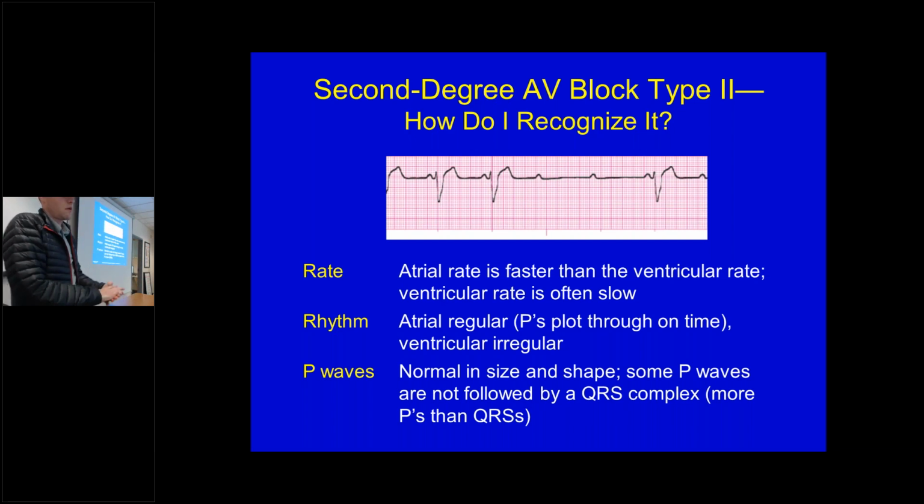So why would, in that big space of missed beats, why don't we see the Purkinje fibers pick up and pace like that? It might not be long enough, or the SA node is still firing, and it is incomplete, so you're not getting those escape beats, right? You don't always have escape beats. Sometimes you'll have arrest for 5 seconds, and there'll never be an escape beat. So that's not automatic. If there's a period of arrest, you're going to get an escape beat, that's not automatic. It's just that you might have one.